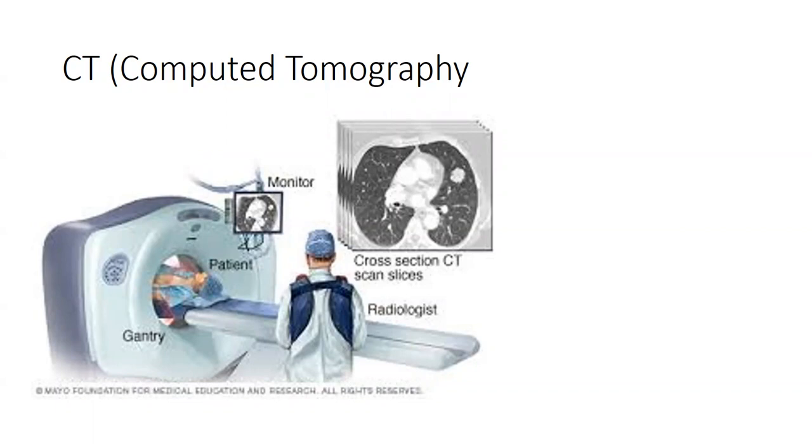So that patient on that gantry there is going into the CT scanner. And how does this work? Well, it is a spinning X-ray source, and opposite the X-ray is the high definition sensor array. So they tumble around one another, and it actually rotates around in a helical fashion as it goes through the patient. And you will take a scout film to program how often you want to image, because they can actually repeat this hundreds of times a second to get high resolution imaging.